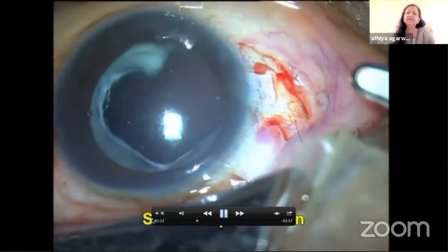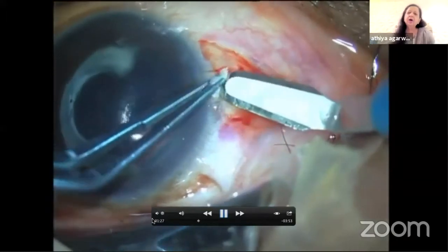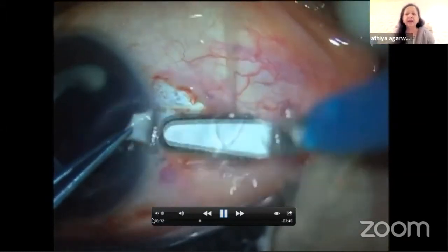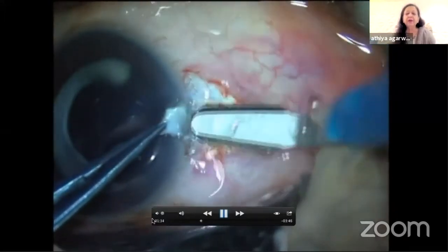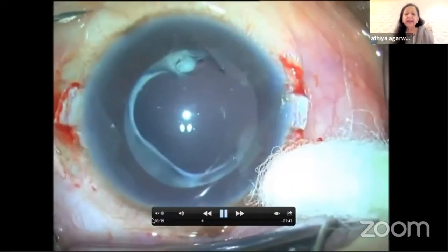But these patients, after so many years, have started to come to us either by referral or as our own patients who've been operated earlier, let's say by my mother-in-law or someone like that. So what I'm planning to do in this case is a glued IOL scaffold.